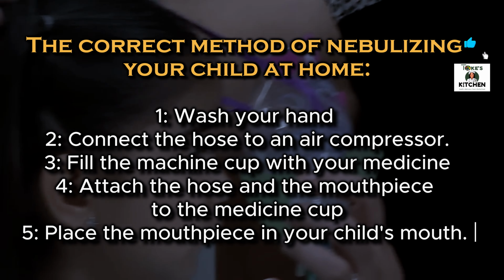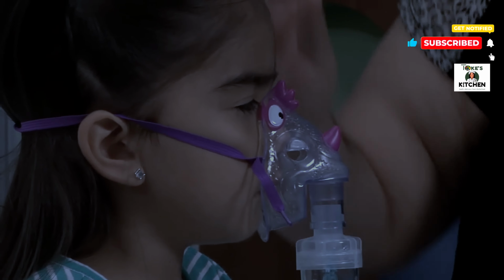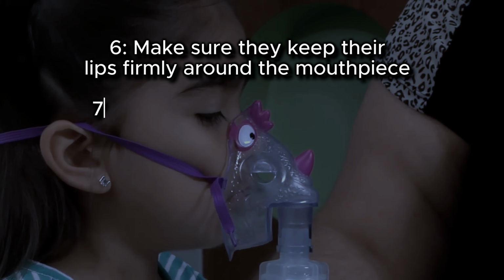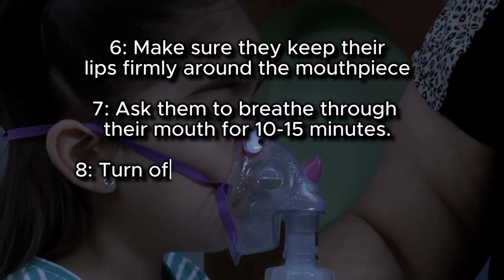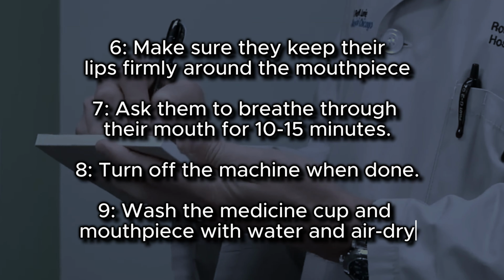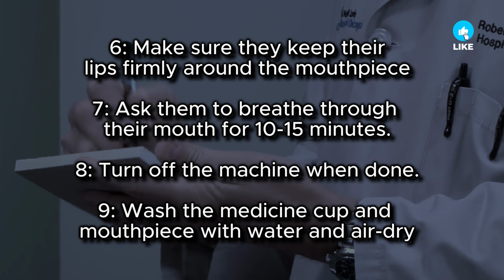5. Place the mouthpiece in your child's mouth. 6. Make sure they keep their lips firmly around the mouthpiece. 7. Ask them to breathe through their mouth for 10 to 15 minutes. 8. Turn off the machine when done. 9. Wash the medicine cup and mouthpiece with water and air dry.